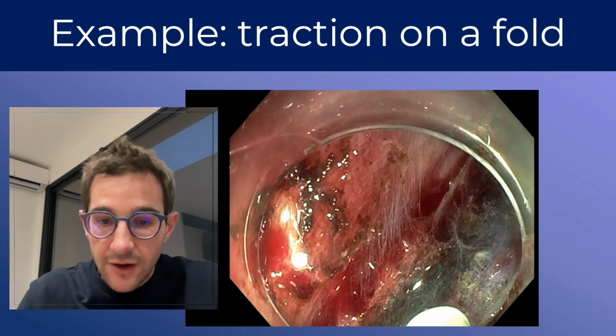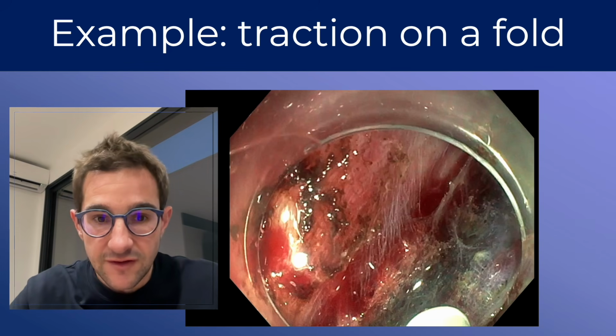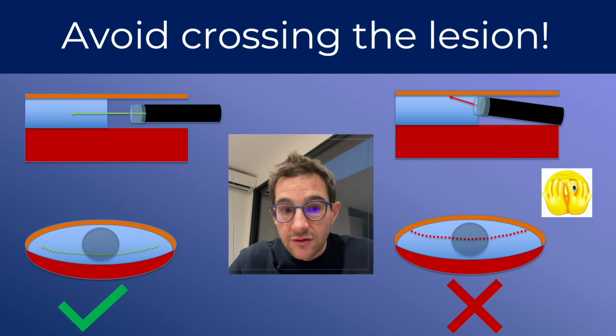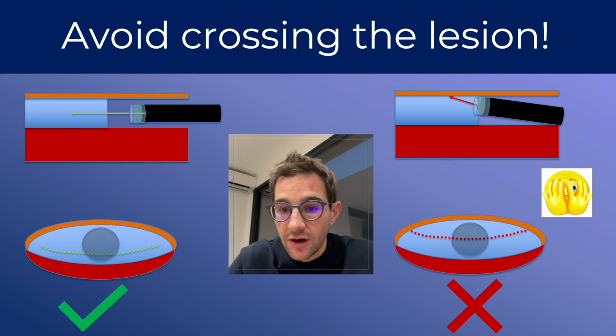So, blue layer close to the muscle and without touching the specimen. Next picture: it should never meet the specimen. It's the second goal in order to stay R0. It means that you will stay at the same position with never an axis going to the specimen, like this.